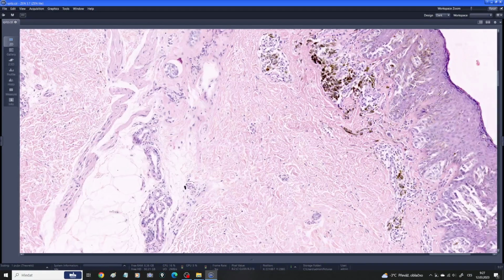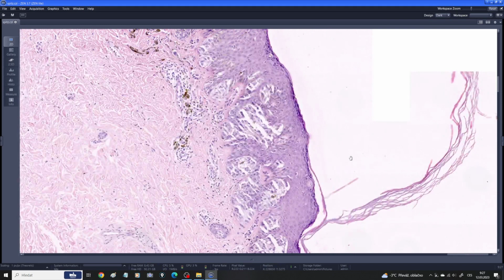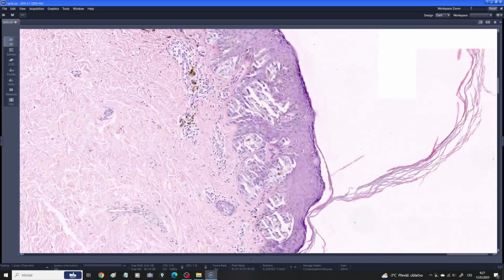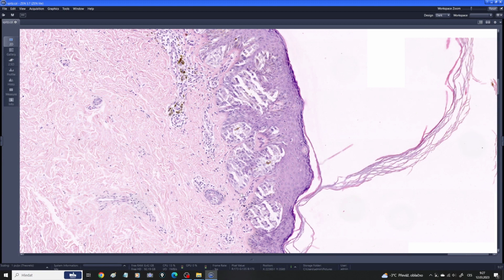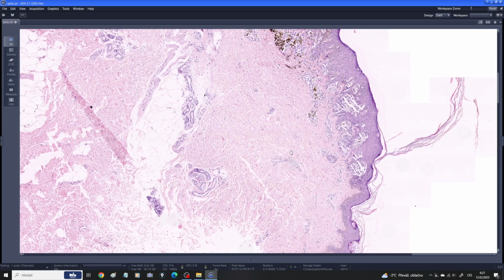And second, as I said, usually you will see it in young patients. And as I mentioned before, you should always think twice before making a diagnosis of melanoma in children, adolescents, or young adults. If you saw this in older patients, you should be worried more, because it can be very easily a melanoma. There is also one special subtype of melanoma which is called Spitz melanoma or Spitzoid melanoma. But if you see this in a child, you should always think of a Spitz nevus.